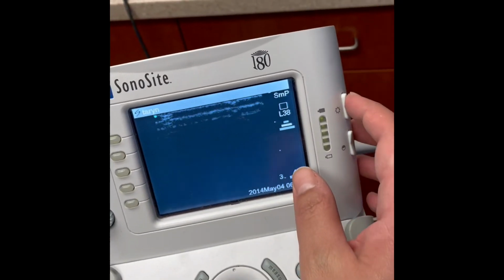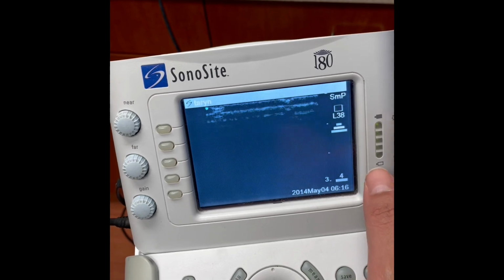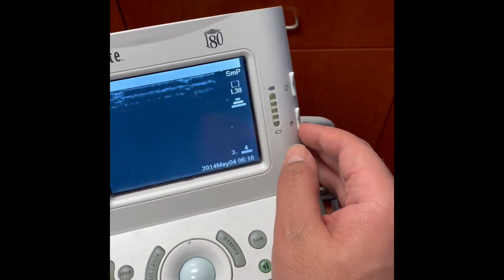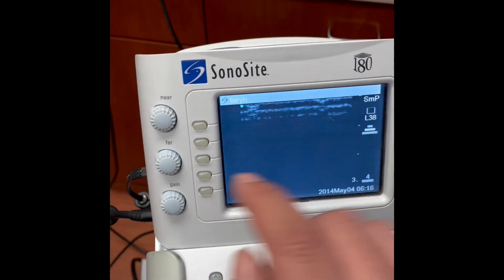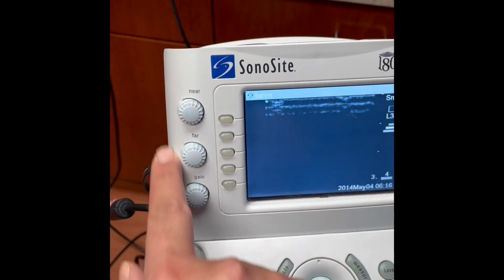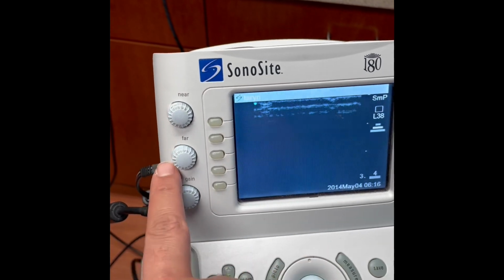And also on the side here, you can mess with kind of the screen brightness and everything like that, but typically I don't mess with these on the side. These really work well because they help the image kind of resolution and quality.